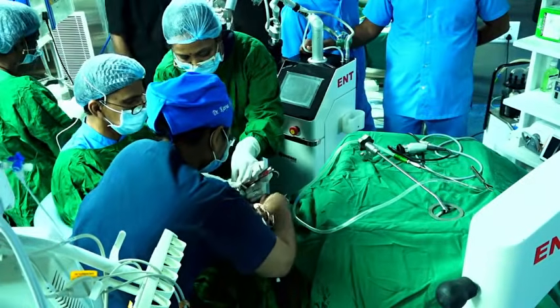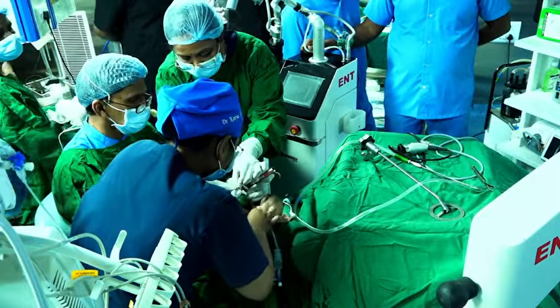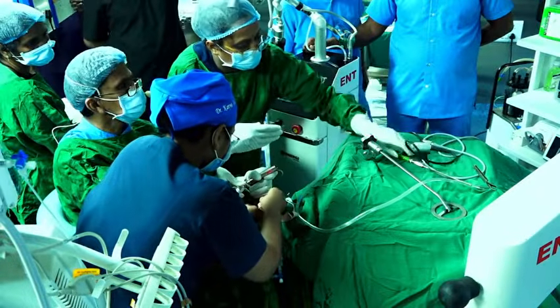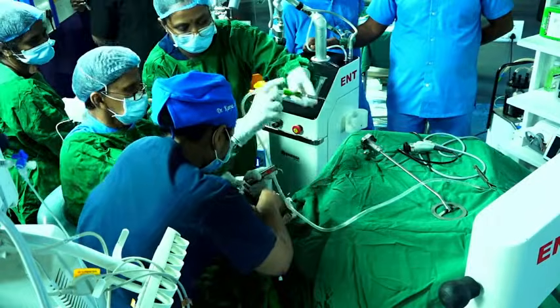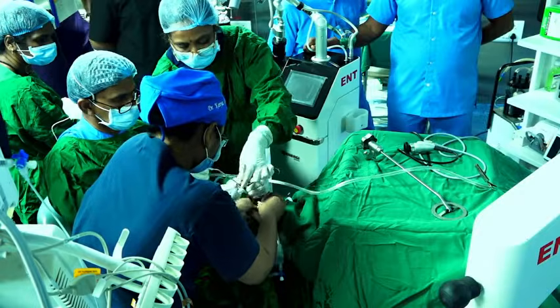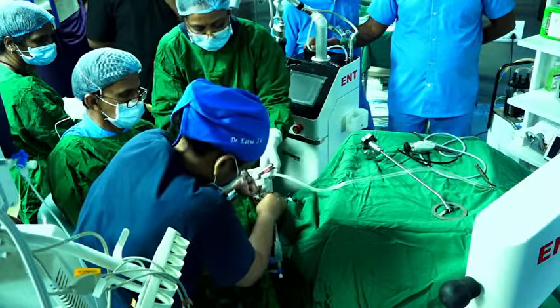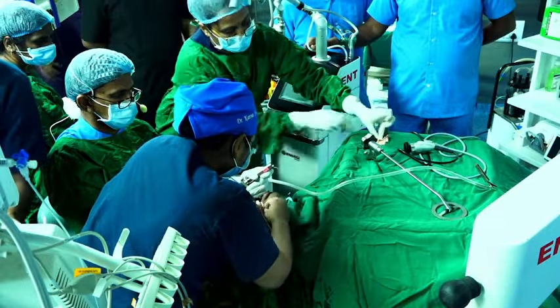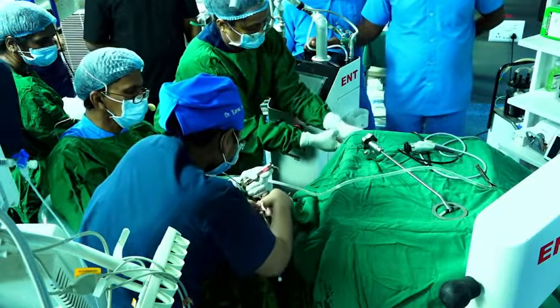Since it was above the vocal cord, we are repositioning the ET tube again. It will stick to your gloves. Yeah, it's deflated. Suction. Let it be there so that I can re-enter.